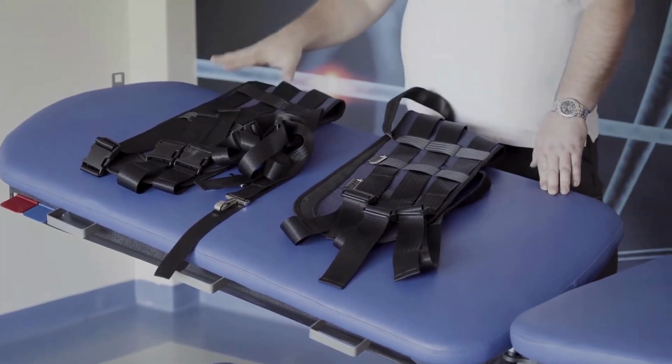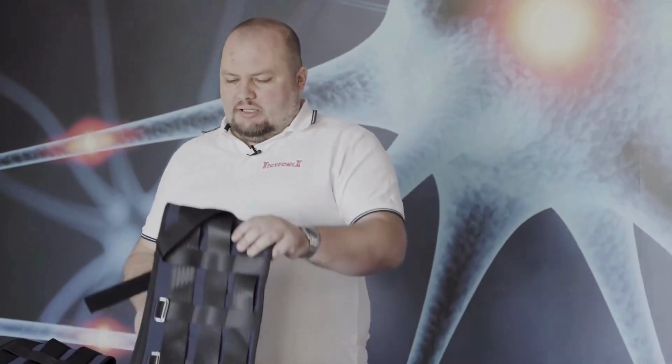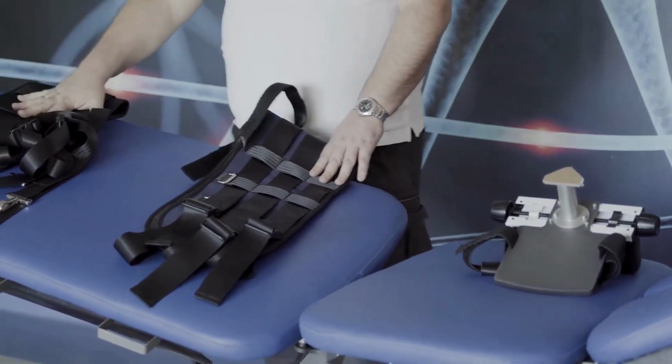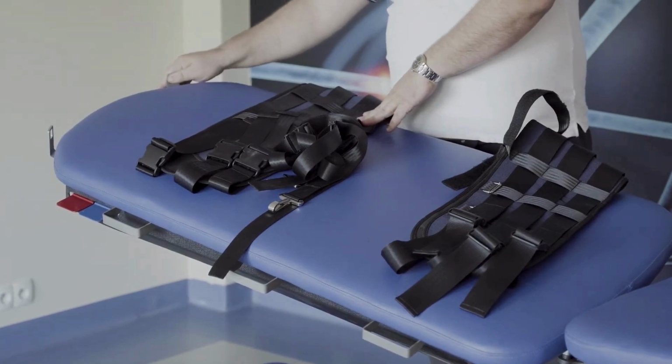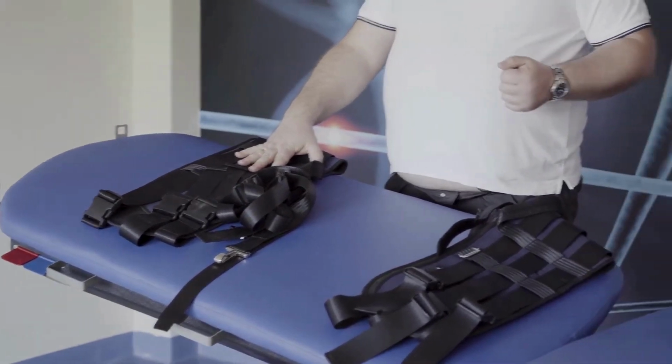For that part and for lumbar traction, we also have two belts. This is the belt for the thoracic part, which allows you to stabilize the patient on the table. And this is the lumbar belt, which is attached in this place and pulls the patient's pelvis with legs away from the thoracic cage, which is very important.